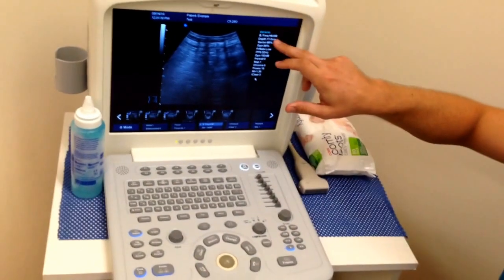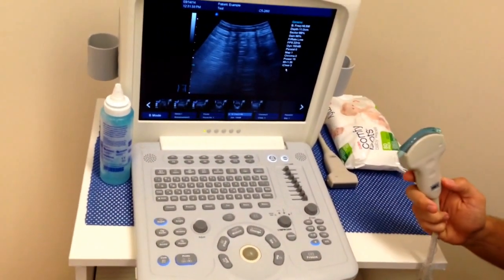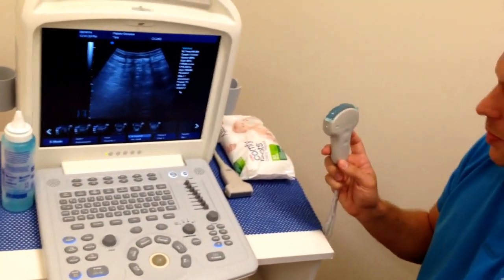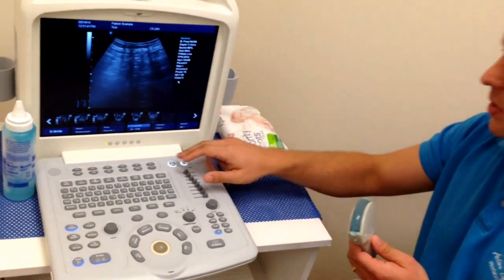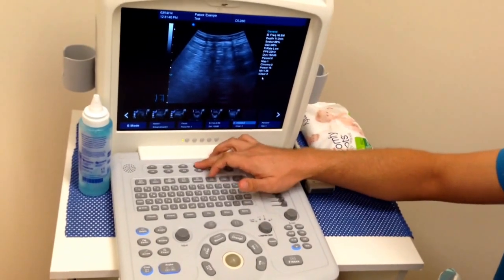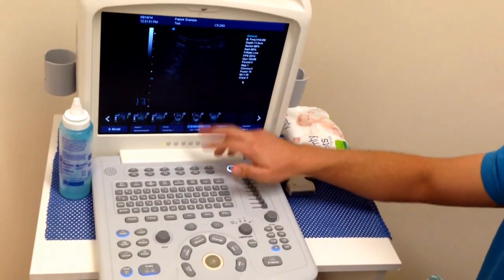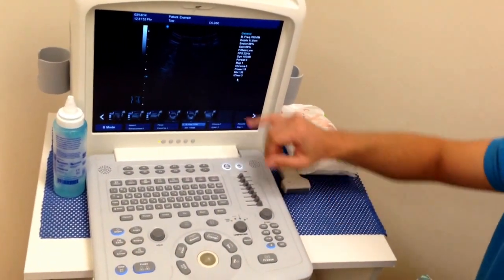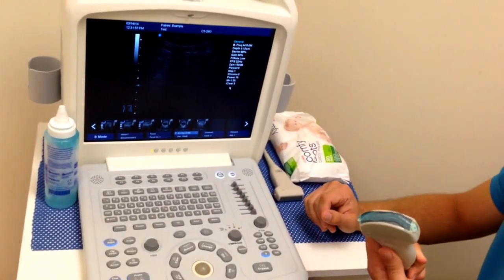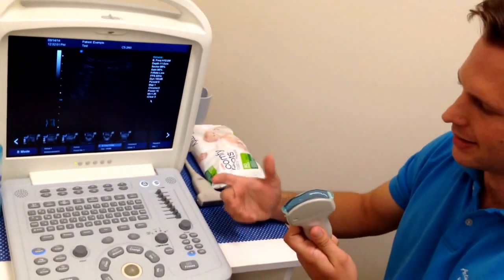The next thing we'll have a quick look at is frequency. As I said, different probes are going to have different frequencies, but a lot of probes will also give you the option of being able to change the frequency. On this particular machine, we have our frequency on the soft menus down the bottom. We're going to change this frequency from 6 to 7.5 and up to 10, which is going to give us really good definition.